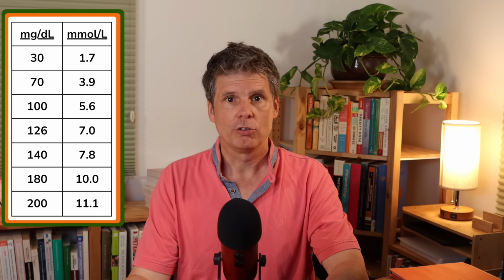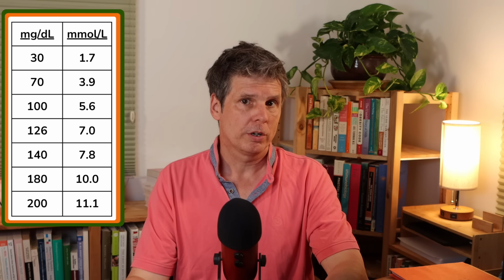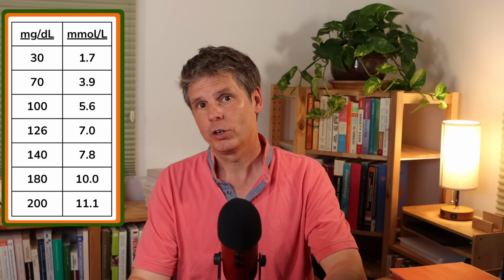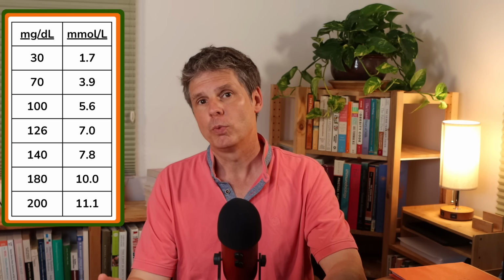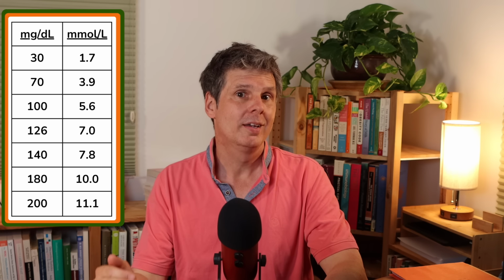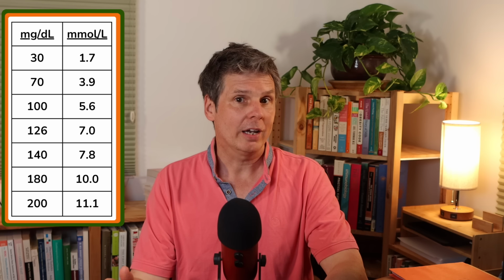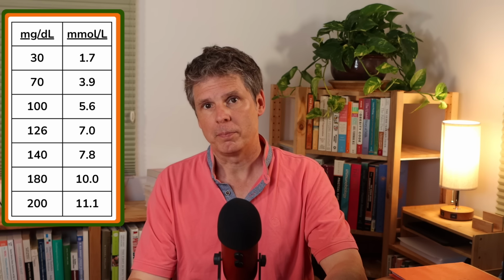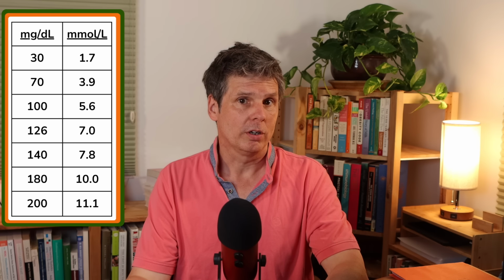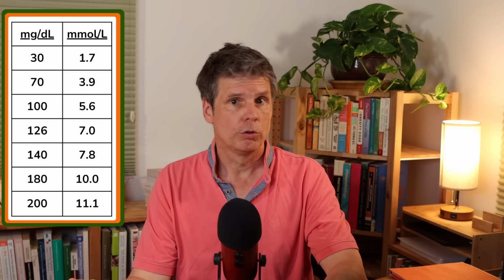Signs of such early stage glucose intolerance that are apparent from your CGM data would be regular blood sugar spikes to 180 milligrams per deciliter or higher, or if your sugar level is in the 140 to 180 milligram per deciliter range for extended periods of time after meals, such that it adds up to more than an hour per day. To me, this is actually the more impactful use of a CGM, to identify any issues in our glucose tolerance early so that we can address them, not to totally flatten an already normal glucose curve.